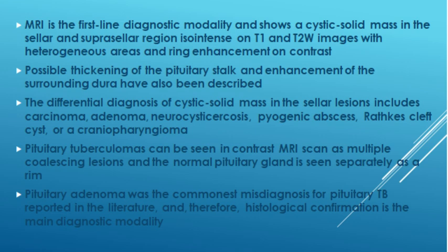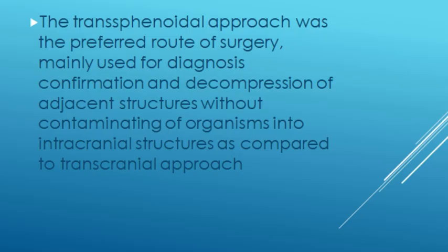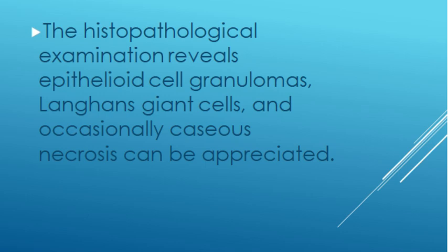Transsphenoidal, transnasal, endoscopic excision and biopsy is the preferred route for surgery, where we can obtain tissue for diagnosis without spreading the disease to the intracranial compartment, which is very easily possible if we go through the intracranial route.